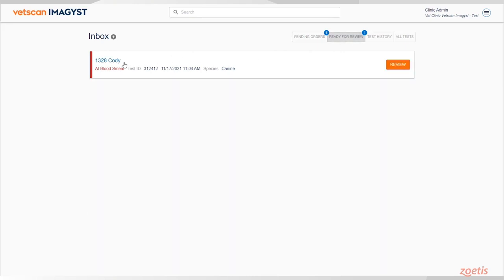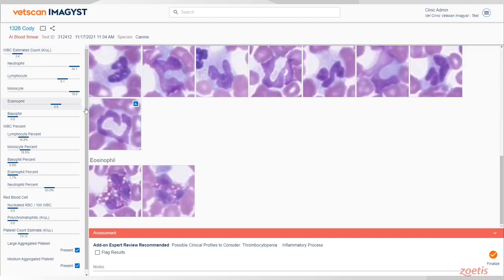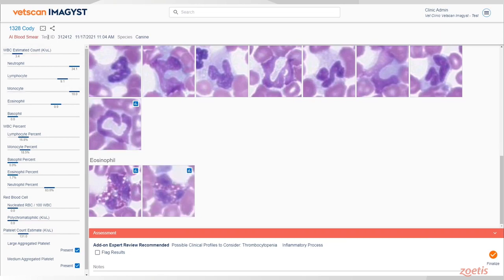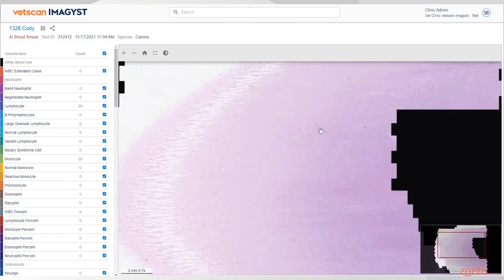If you find your specific test order and click on the Review button, the report will open in the Report Viewer. Imagist will automatically select the four best images to include. You can select additional images which you want to include in the PDF report.